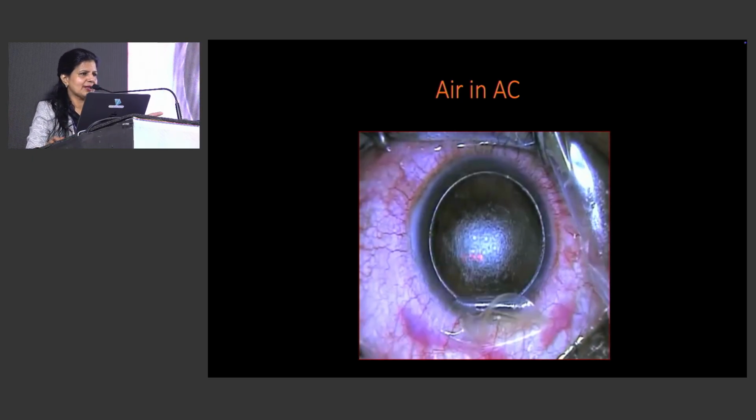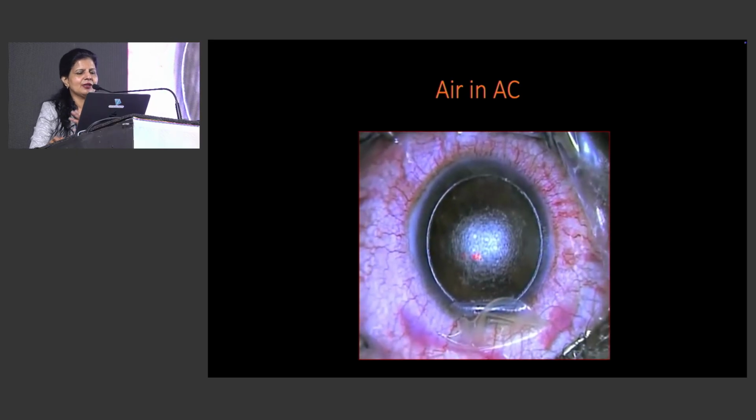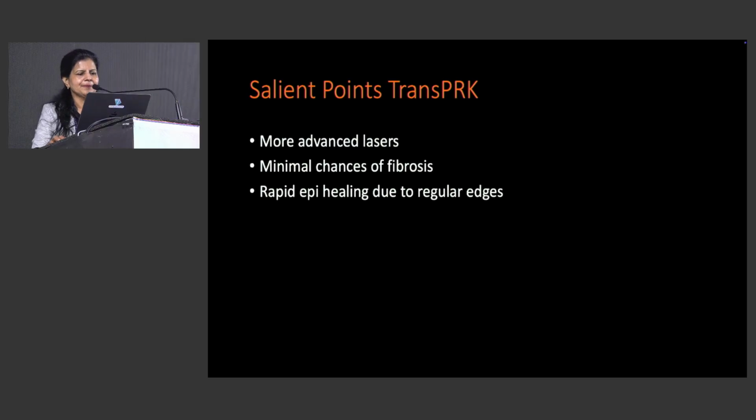Now, if you're able to track through and through, it's good. You can switch the tracker off as well, but not recommended. Now, coming to the second procedure, there's not much to show over there because you're just ablating straight on and then coming out. So the chances of complications, because you're not touching the eye, is much, much less.